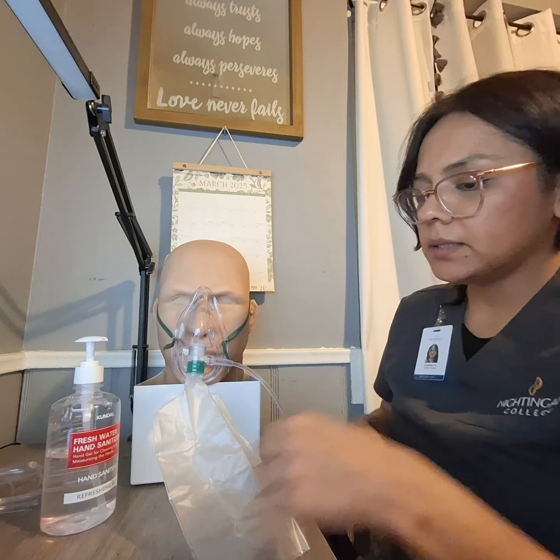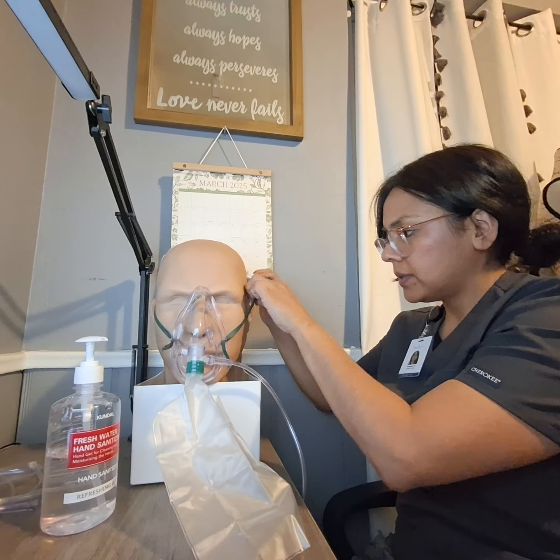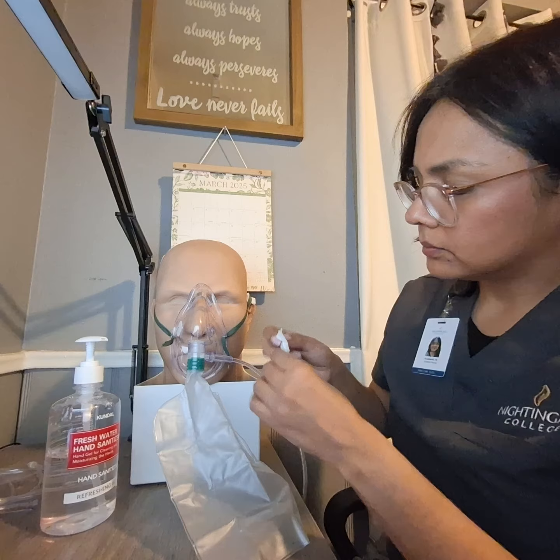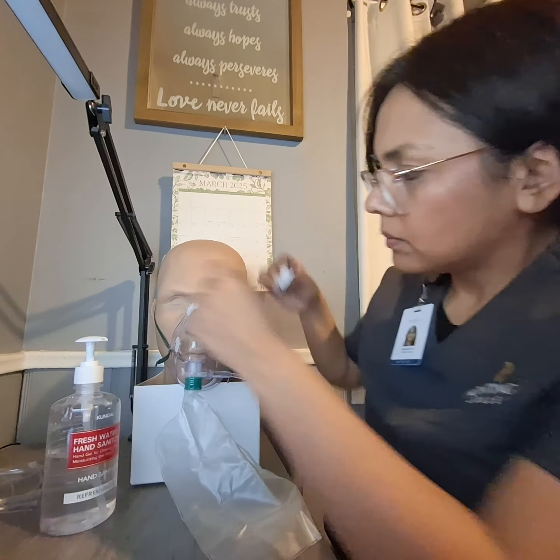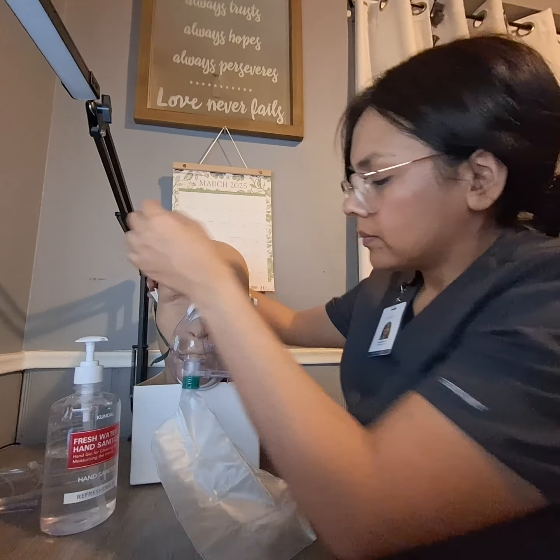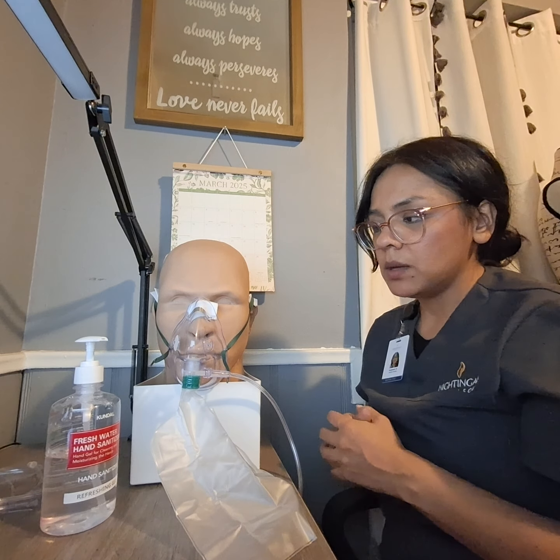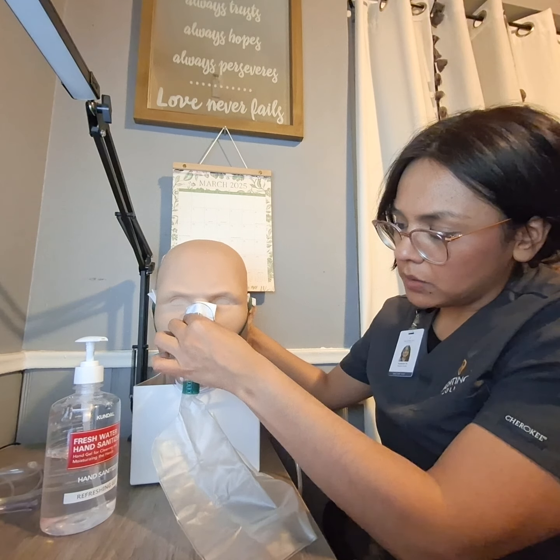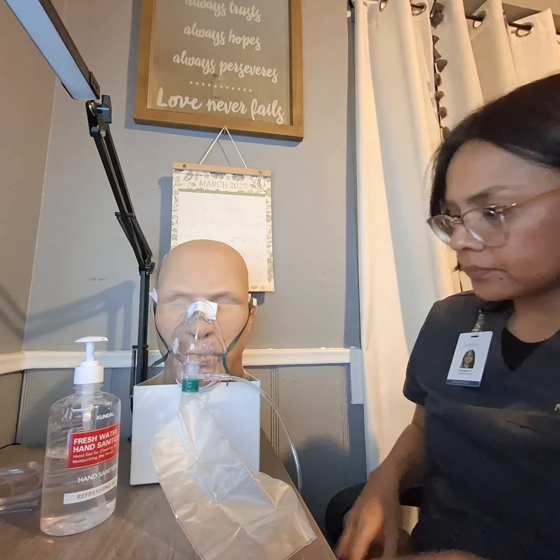All right, Mrs. Garcia, so I will take gauze pads, apply those between your ears and the straps to ensure skin integrity. I will be checking for skin integrity every 4 hours at a minimum to ensure there's no breakage or irritation. I will cinch the metal band here on the nose to make sure that the oxygen flows properly.